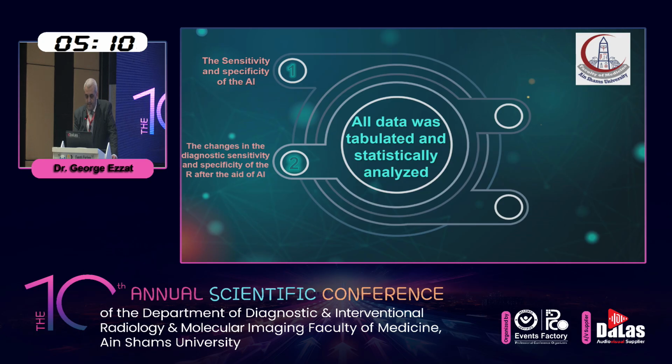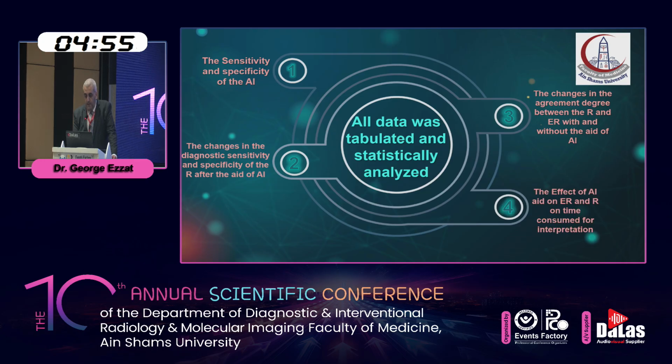We tested the sensitivity and specificity of the AI, the changes in the diagnostic sensitivity and specificity of the resident after the aid of the AI, the changes in the agreement degree between the resident and the consultant radiologist with and without the AI, and the effect of AI on time consumed for interpretation for both the resident and the consultant.